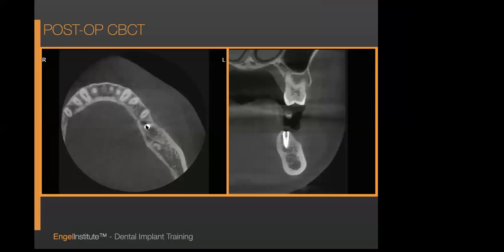But if you look here, this is the platform of the implant. It's exactly where the design was. And if you look here, ideal. We planned it underneath the tooth, and the tooth is going right towards the palatal cusp of the opposing molar. Perfect. This is a really, really good day.